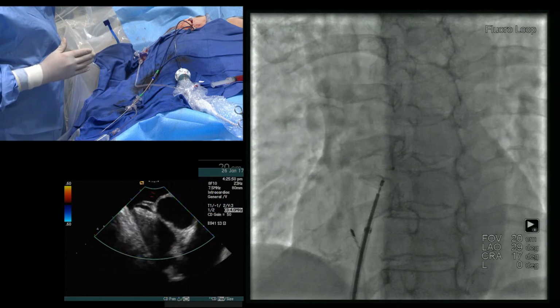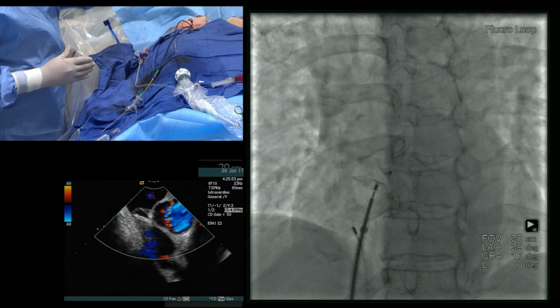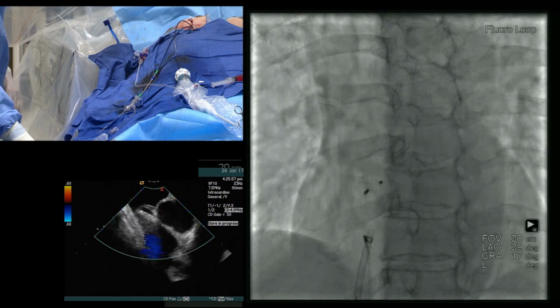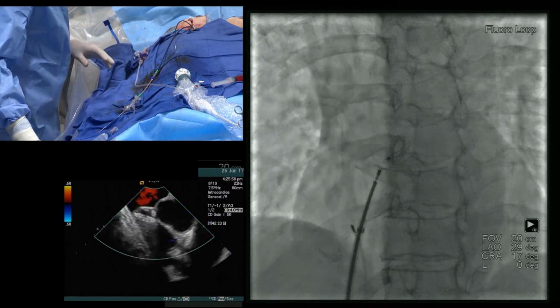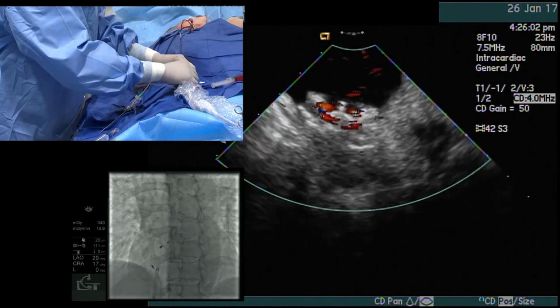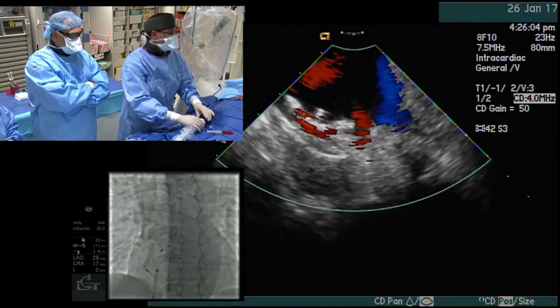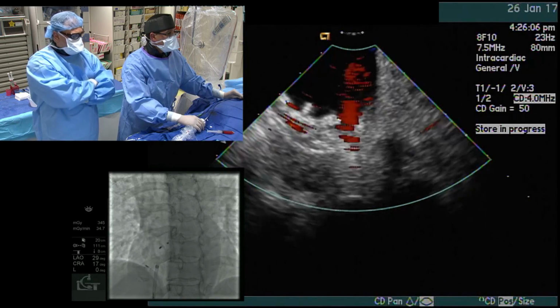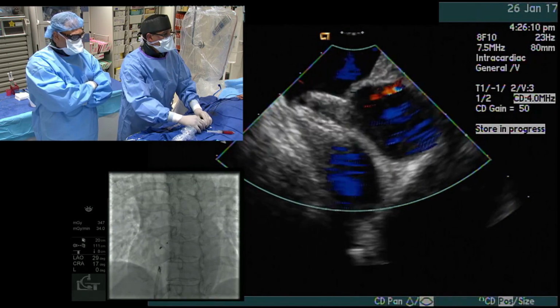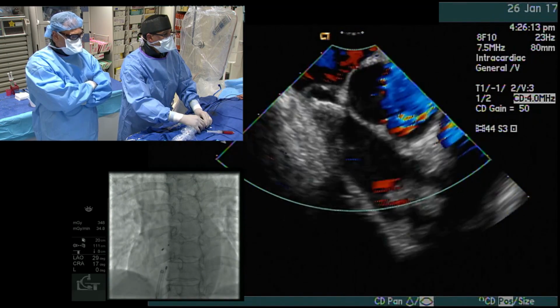And you know then that you're probably in good shape, in a good position. So there, it orients it. It's about 10:30, 11 o'clock. Okay? So now we're just going to image a little more, and then we're done. So Andreas, let's show one good ICE picture of the device. So I like that. You can see on the ICE, the device looks beautiful, and there is no color flow signal going across.